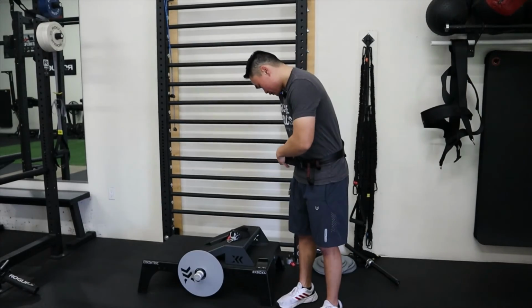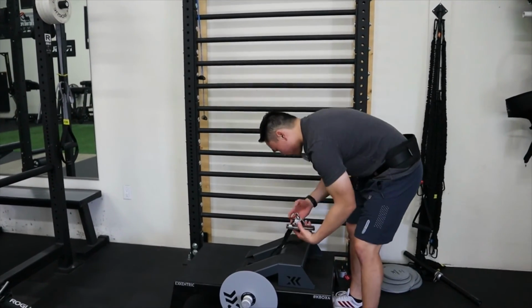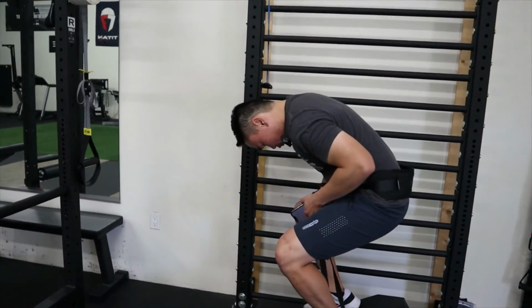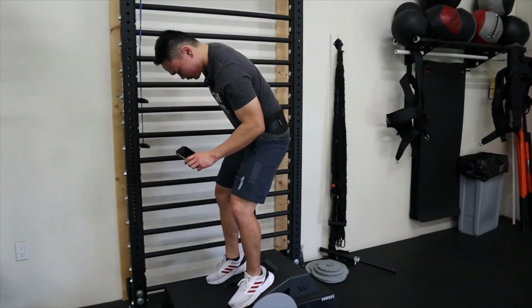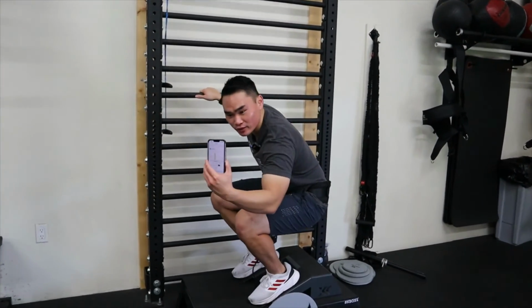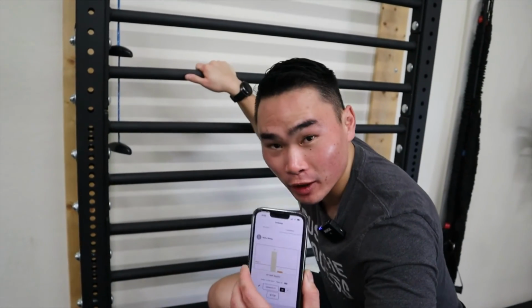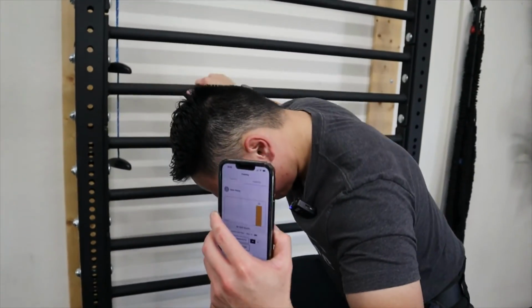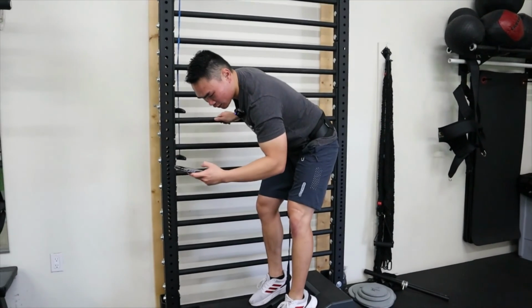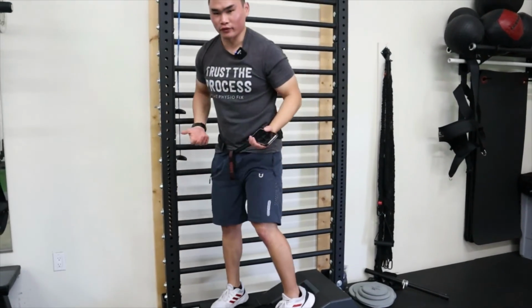The K meter will tell you if I'm working hard or if I'm being lazy. But since I'm just making a video, I'm not really working out right now. I'm just going to push softly, but I'll show you guys how this thing works. Okay, so I'm in. I'm not locking out, but oh well. I'm going to squat down, and as you can see, there's a bar graph here. If I squat up, it'll pop up a number here. If I squat up faster, it'll pop up a different number, and so on. So I can track some progress, or I can track the level of effort that my patient's giving.